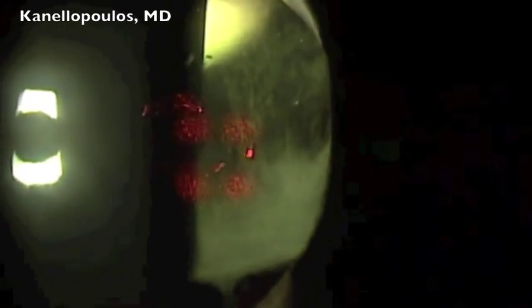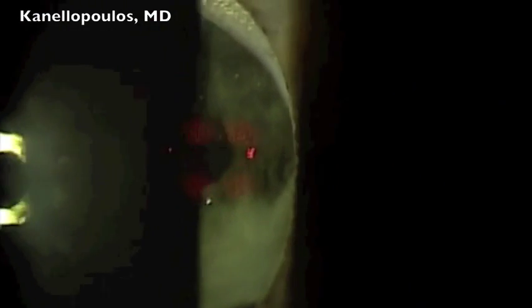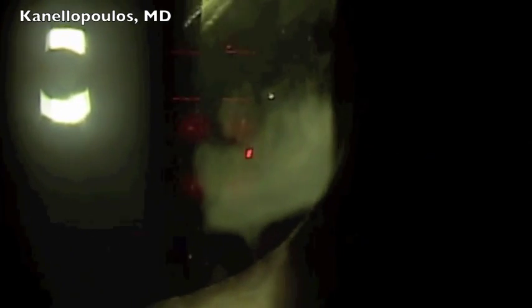There is a group of ophthalmologists that prefers to do a can opener posterior chamber capsulotomy. I prefer this technique, the vertical line going from superior to inferior, and then extending each temporal and nasal radial horizontal line from the center out, because I feel there's less spots needed this way, and also that the 4 quadrants of free capsular tags that are created, posterior capsular tags with time, contract and create a nice round or oval capsulotomy.